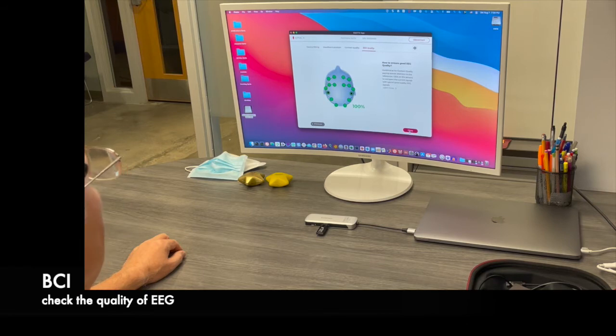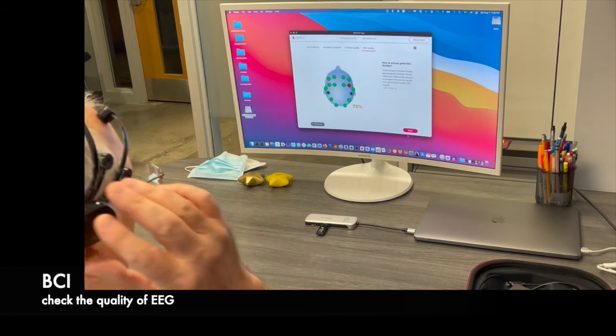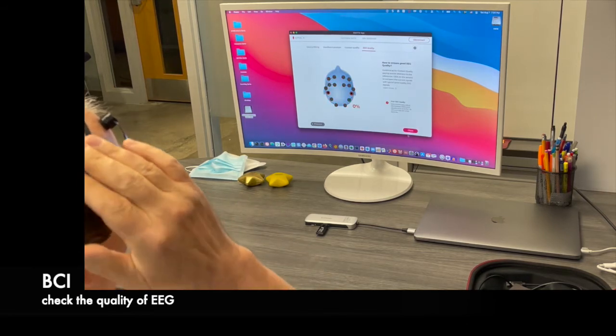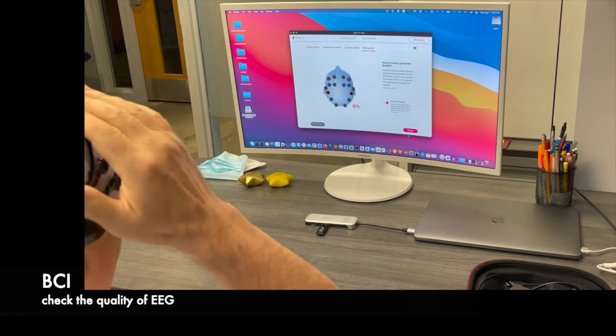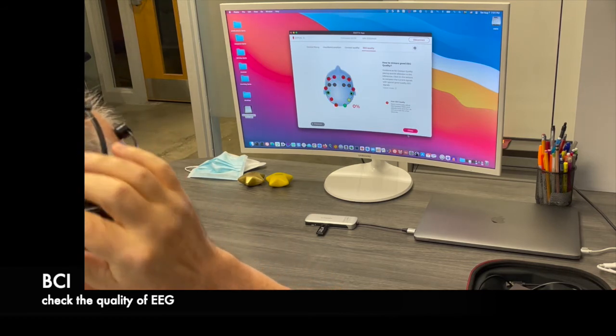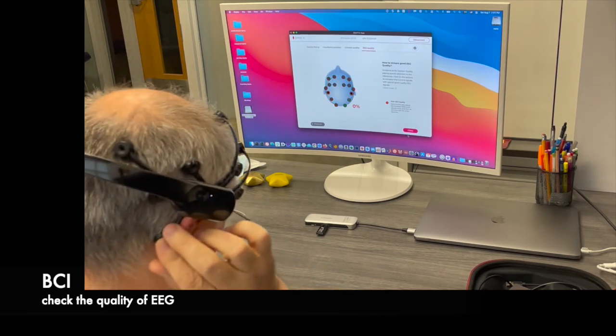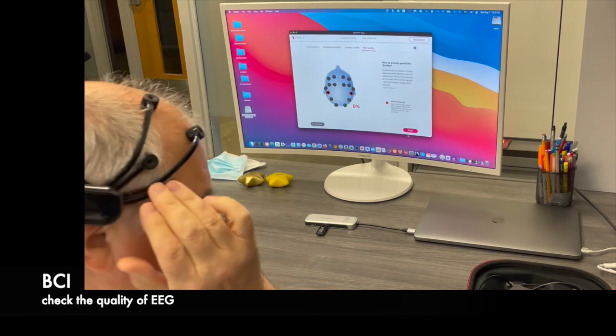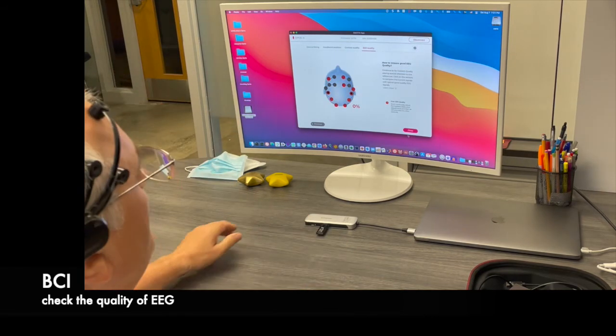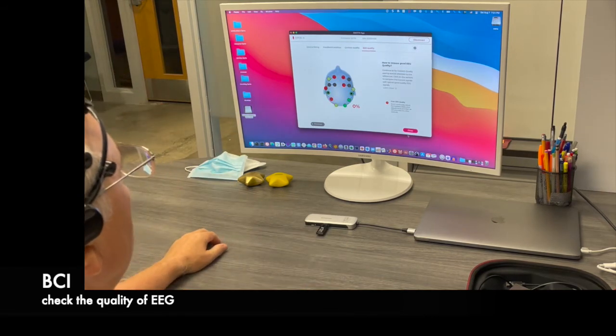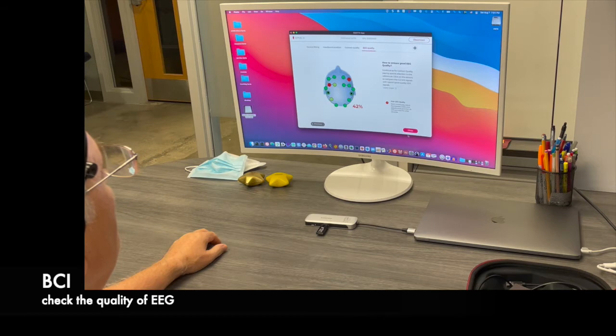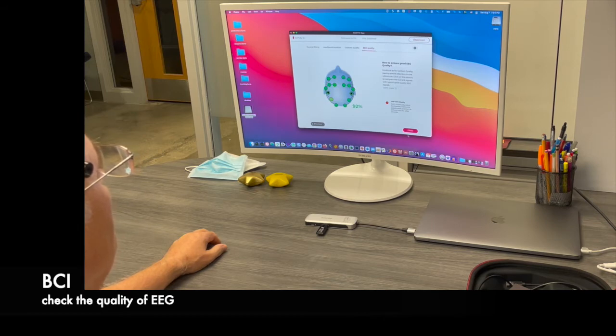Some electrodes go off. If I move the headset, you see that the signal kind of goes off. Even if you move the electrodes around, you'll have to wait a few seconds until the whole set comes back to normal and records correctly again.